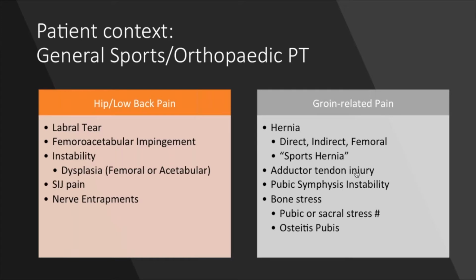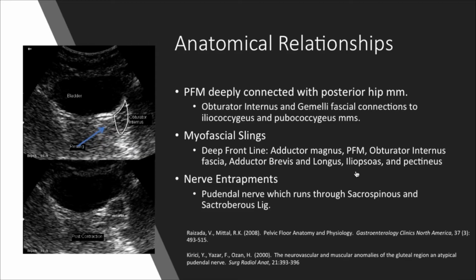So now we're going to move into how a pelvic floor therapist and a general sports orthopedic therapist will utilize ultrasound to assess pelvic floor muscle control and help guide rehab based on what we see on the images. So when looking at an orthopedic patient or a sports patient, you want to have a good differential diagnosis to kind of help guide your treatment and where you need to focus.